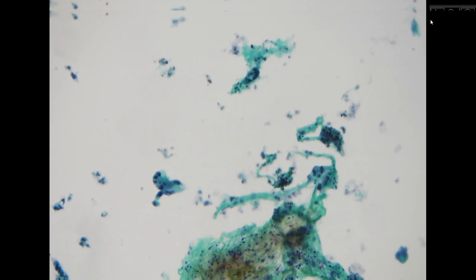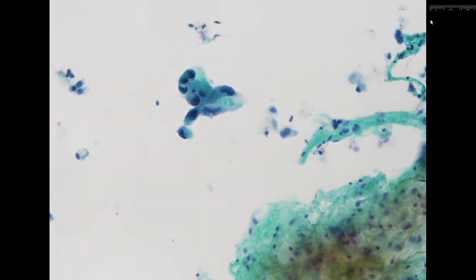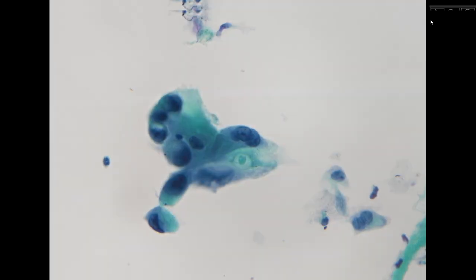So we have a necrotic background and diagnostic cells of adenocarcinoma. We can send these out as adenocarcinoma. Again, in this cluster, you can see the size of the cells is very big, and the nucleoli are also very big and prominent. So this is consistent with adenocarcinoma of the pancreas, high grade.